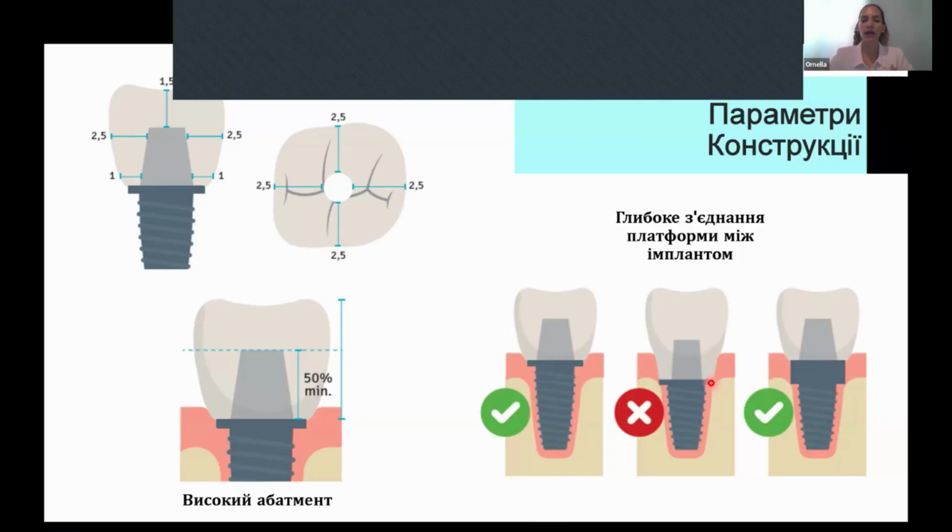If I screw my standard T-base, because normally they are very short, what problem could I find here? I could not ensure the minimal thickness when I go inside my gum. And also when I screw my T-base, the height is not enough, or is not the recommended one from Graphene.